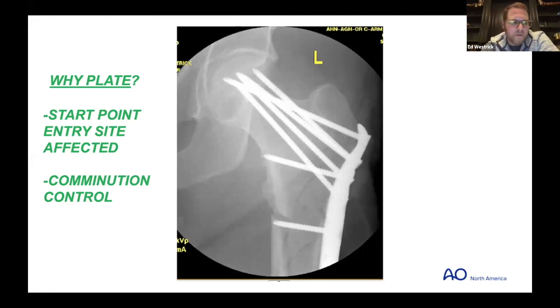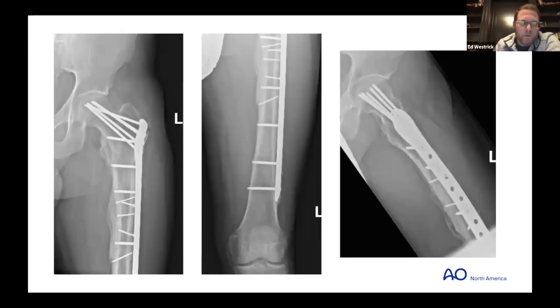We're not doing the things that surgeons 50 years ago learned the hard way, stripping all these fragments and taking out fragments. And so we're using the main fracture lines to reassemble and key in our reduction and establish all of those parameters. And he went on to do well. He healed and did well.